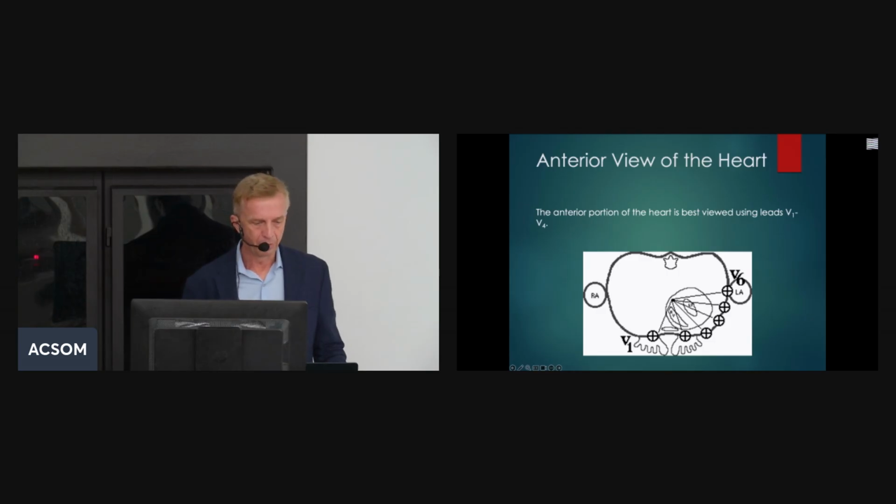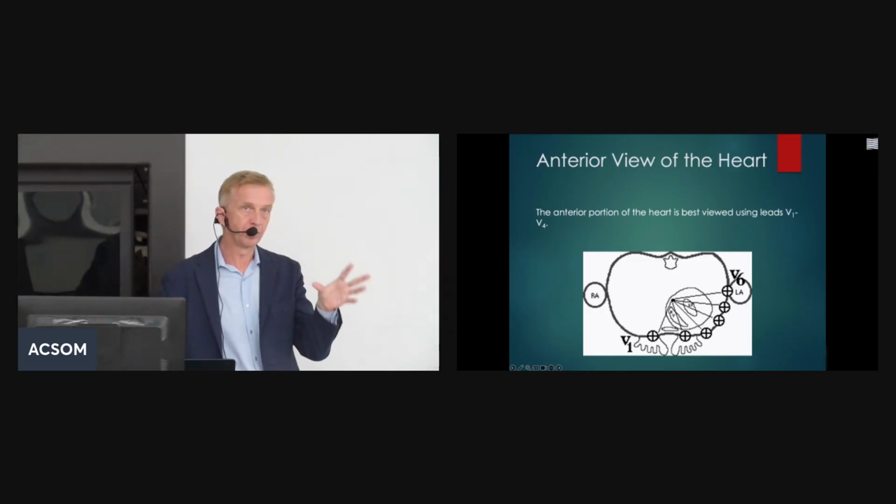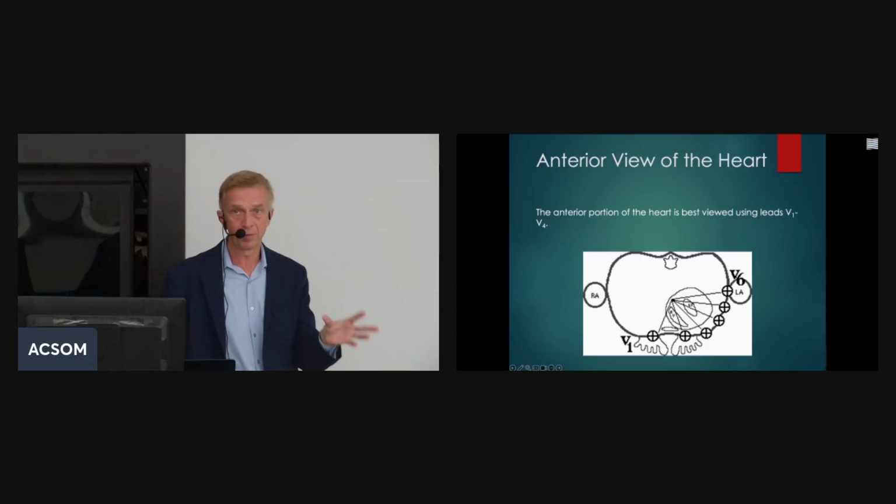I hope you learned something from the basics. It becomes more and more complicated when you evaluate EKGs and pathology, but you really have to start with the structure. When you read every electrocardiogram the same way, it is less likely that you will miss any pathology.